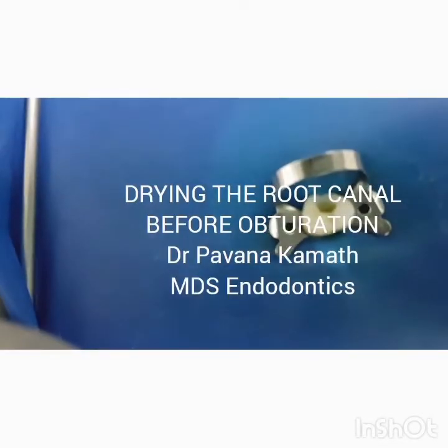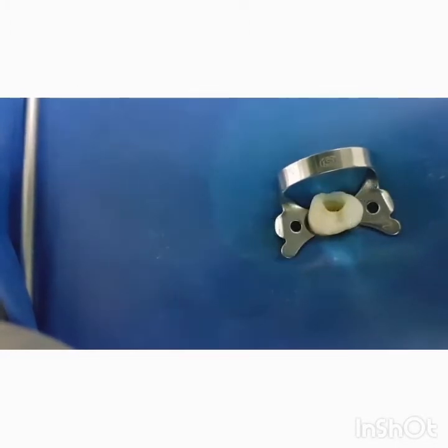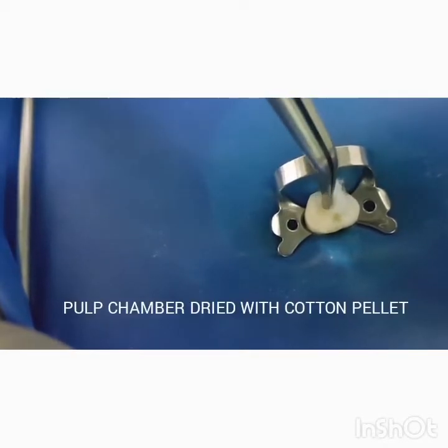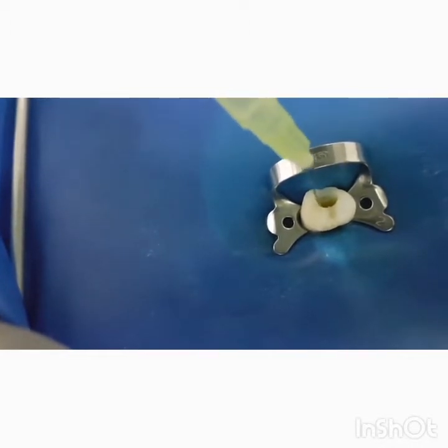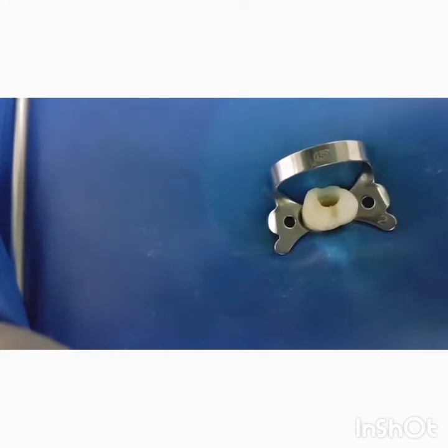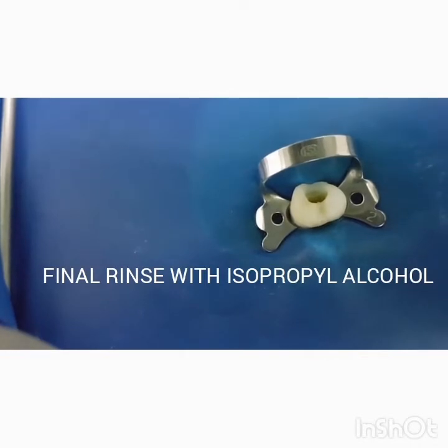Drying the canal with paper points before obturation: the pulp chamber is initially dried with a cotton pellet. This ensures that the major amount of moisture present within the pulp chamber is eliminated. Subsequently, aspiration and applying back pressure with the irrigation syringe helps in significantly reducing the amount of moisture within the canal.